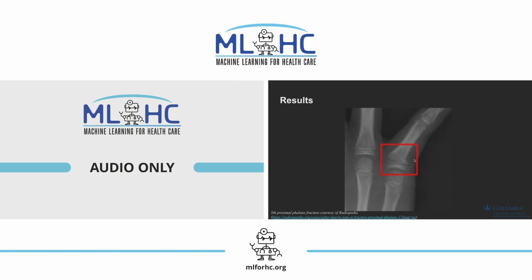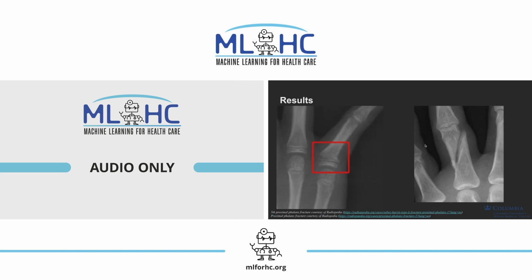If we zoom in on that, it gives a good indication of what a pediatric fracture can look like. I would note that in this case, we can see how the bone has a tendency to bend rather than fully break. Many pediatric fractures are called incomplete fractures because they involve this incomplete disruption of the bone. We can contrast that with a more typical appearance for an adult fracture, which I added here on the right, in which you can see frank cortical disruption through the bone.